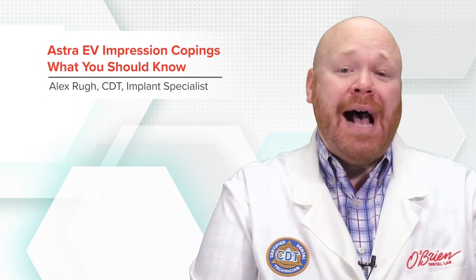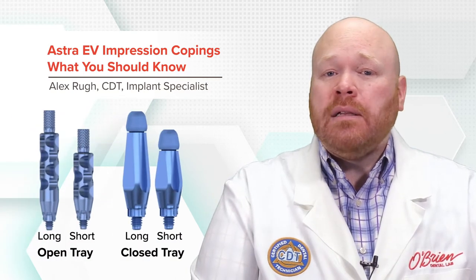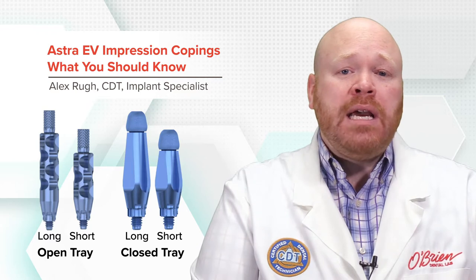Hey everyone, Alex from O'Brien here. Today I want to talk about the impression copings that are available for the Astra EV system. The impression copings for Astra EV are available in both open and closed tray, with long and short variants available for each.